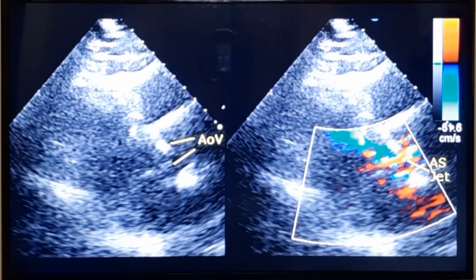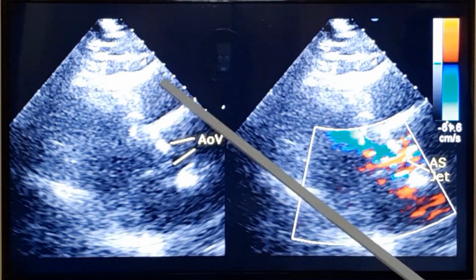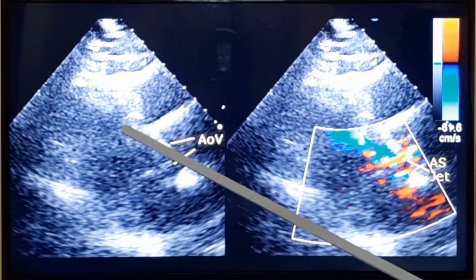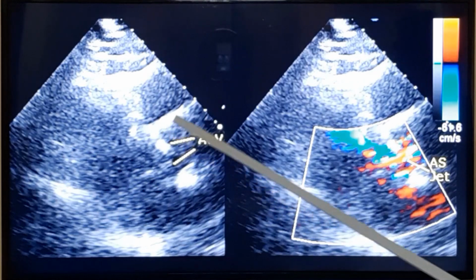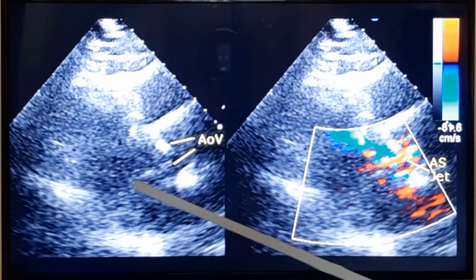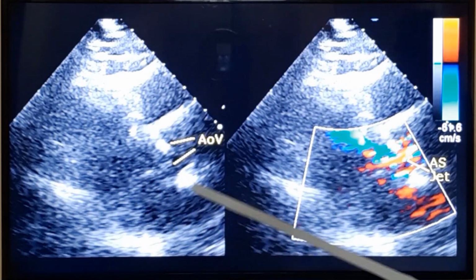This is an echocardiogram in the parasternal long axis view. Obviously, it is a poor echo window as occurs in those with chronic obstructive airway disease. This is the right ventricular outflow region and this is the region of the left ventricular cavity. The interventricular septum is not clearly seen, but you know it is here. And this is the anterior wall of the aorta, posterior wall of the aorta. Mitral leaflets are hardly seen in this image. This is the left atrium.